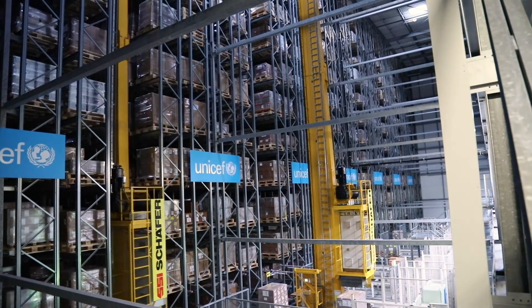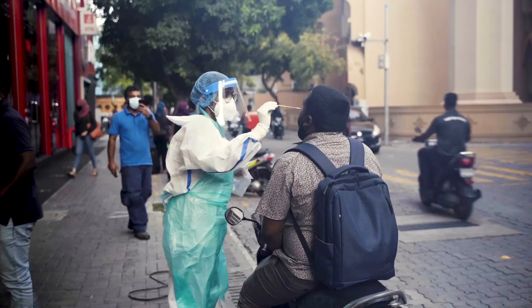And so that's our unboxing of a COVID-19 Rapid Diagnostic Testing Kit. UNICEF is procuring and supplying these kits to countries to use in their response to limit the spread of the pandemic. Stay safe everyone.